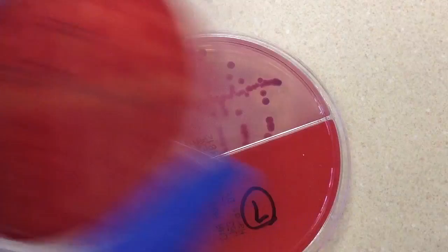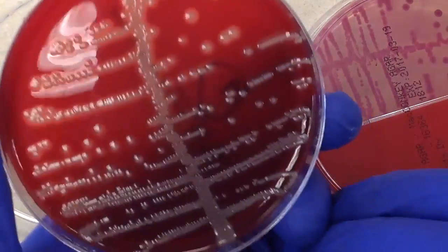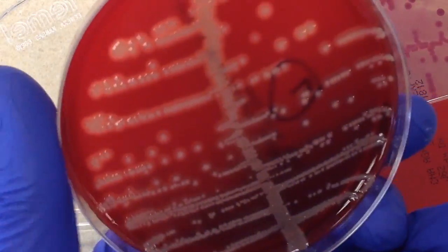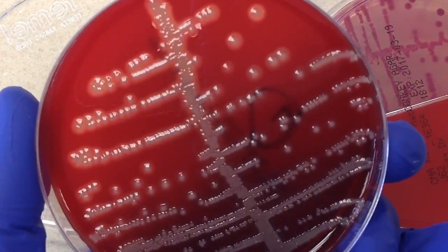Our next urine culture here — let's go ahead and take a look at our sheep blood plate. Now, you can see it on this one: there's beta hemolysis around these colonies.